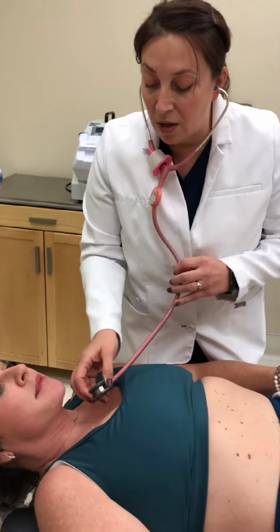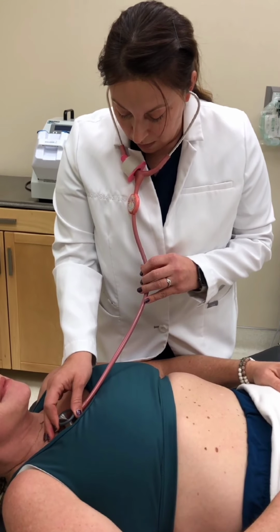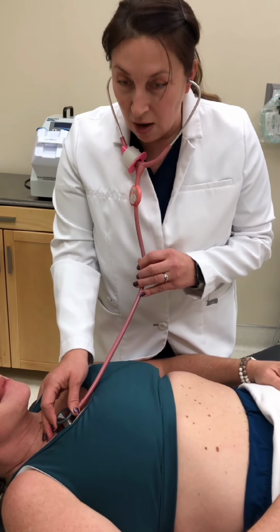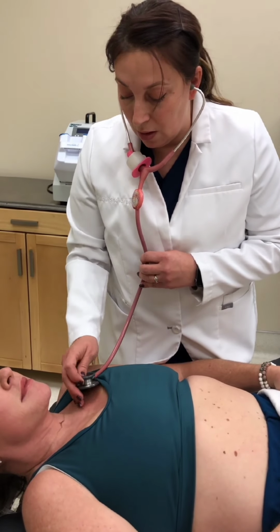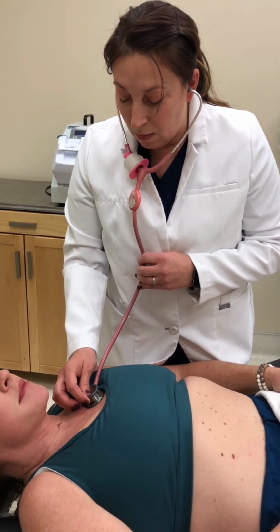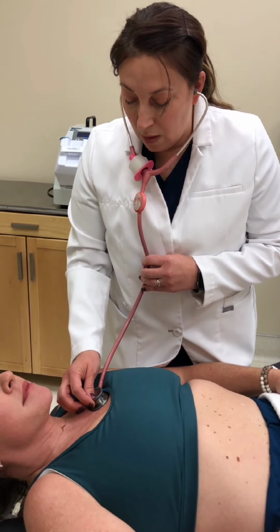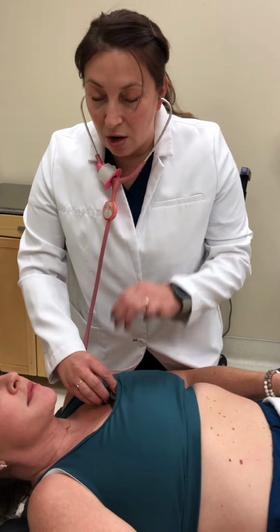Starting with the diaphragm, I'm listening to the pulmonic. I can hear S1 and S2. S1 and S2. Coming down to Erb's point.